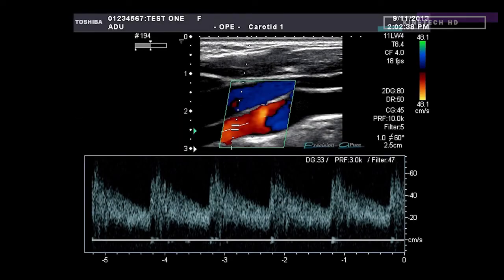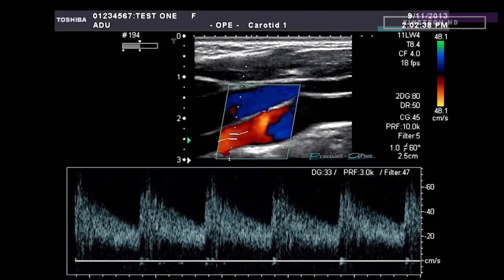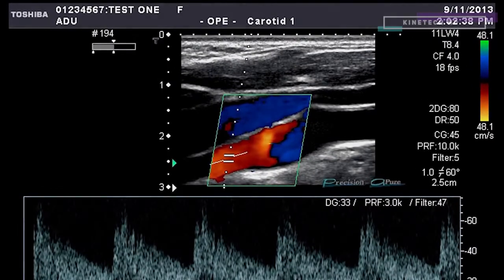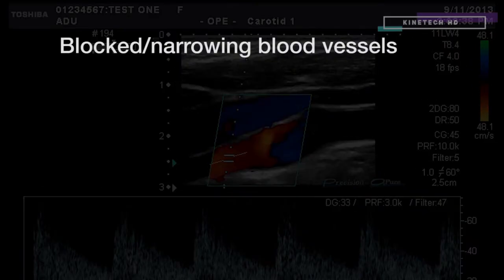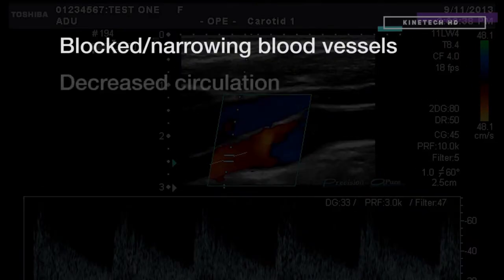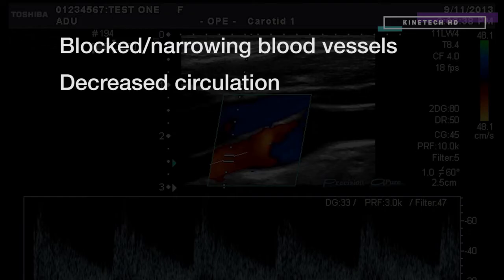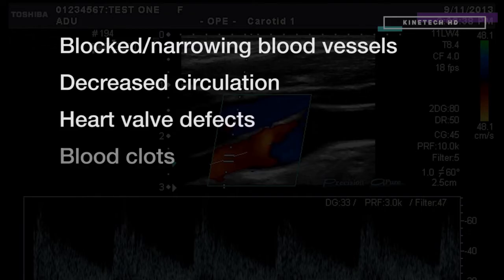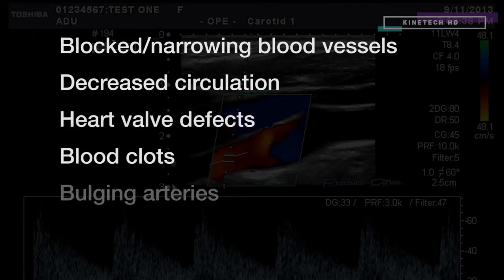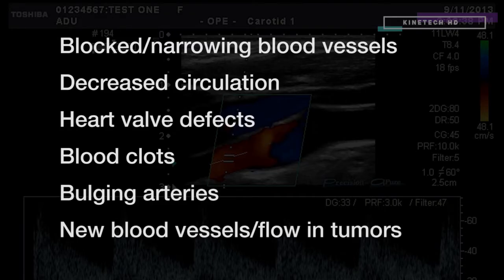This information is displayed in different colors on the final image to show changes in or absence of blood flow, indicating blocked or narrowing blood vessels, decreased circulation, heart valve defects, blood clots, bulging arteries, or even the presence of new blood vessels and flow in tumors.